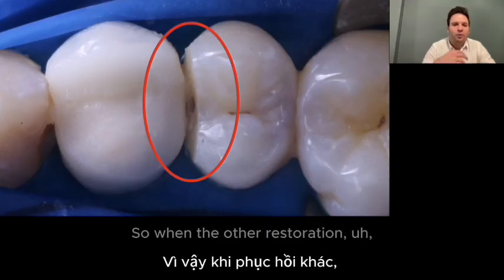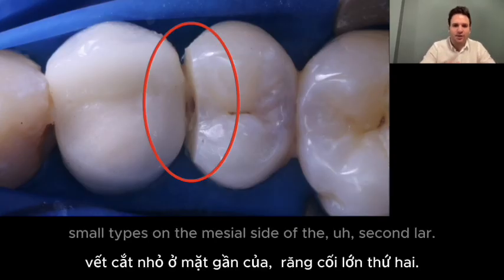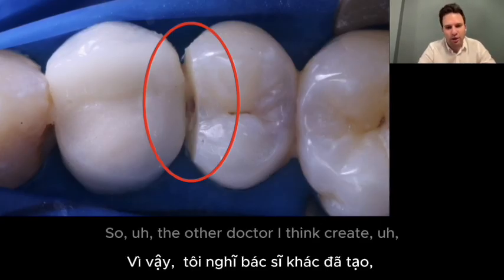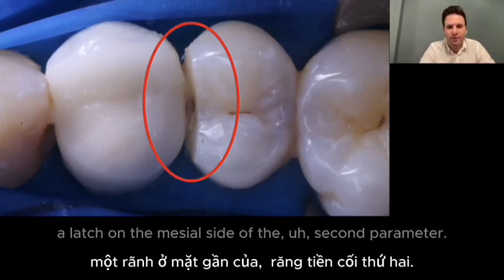When the other restoration was being performed, there was a small touch on the mesial side of the second premolar. So the other doctor, I think, created a ledge on the mesial side of the second premolar.